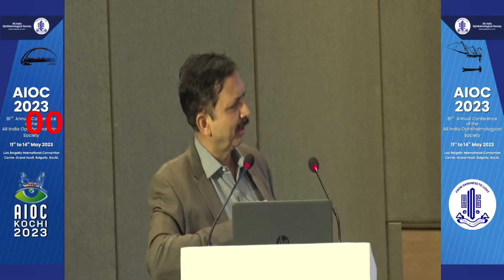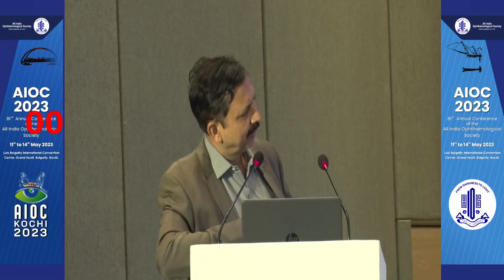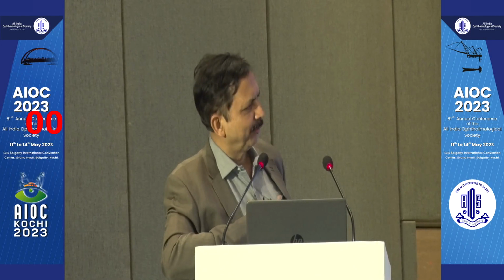You flip the axis, you put in the wrong axis. I prefer to do it as early as possible, before the fibrosis sets in, maybe about 1 to 2 weeks. You want to see the refraction stabilize, say over 1 week or 2. If it doesn't, then I think you should not wait further. Go right in and do it.